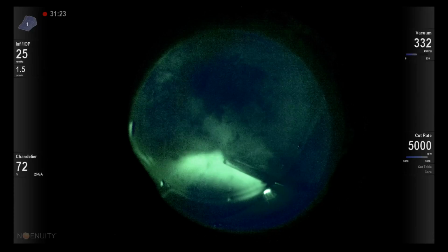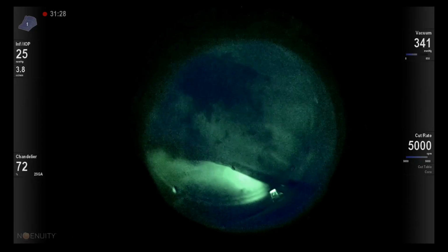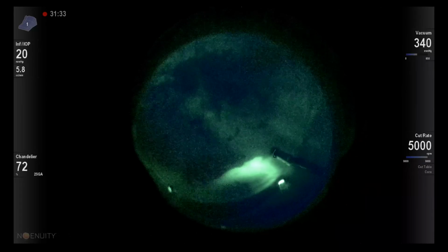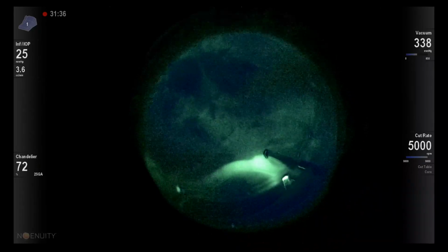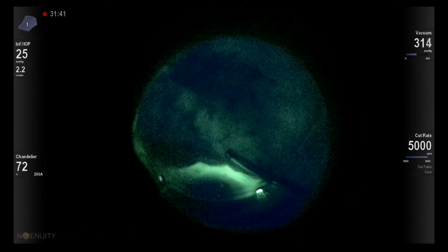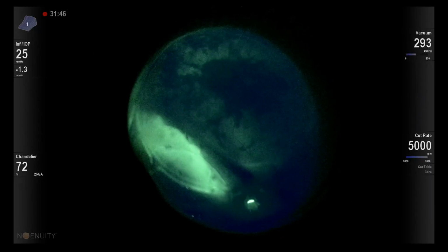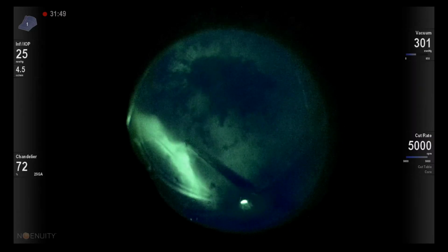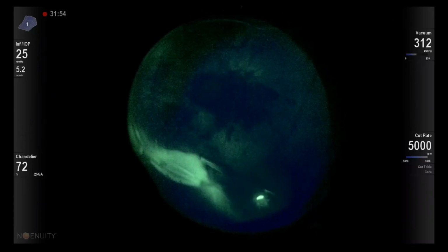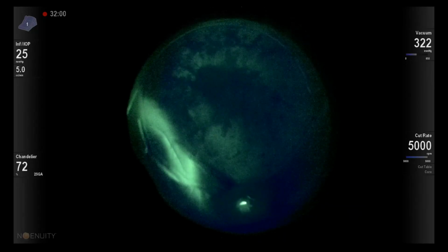So the fluoroscopic view actually enhances my ability to perform more precise surgical maneuvers. This is the beauty of the digital visualization, and it's something that we don't fully comprehend up to now. We aim to achieve a digital view which should be similar to the high-end analog one. And that way we actually lose additional information.